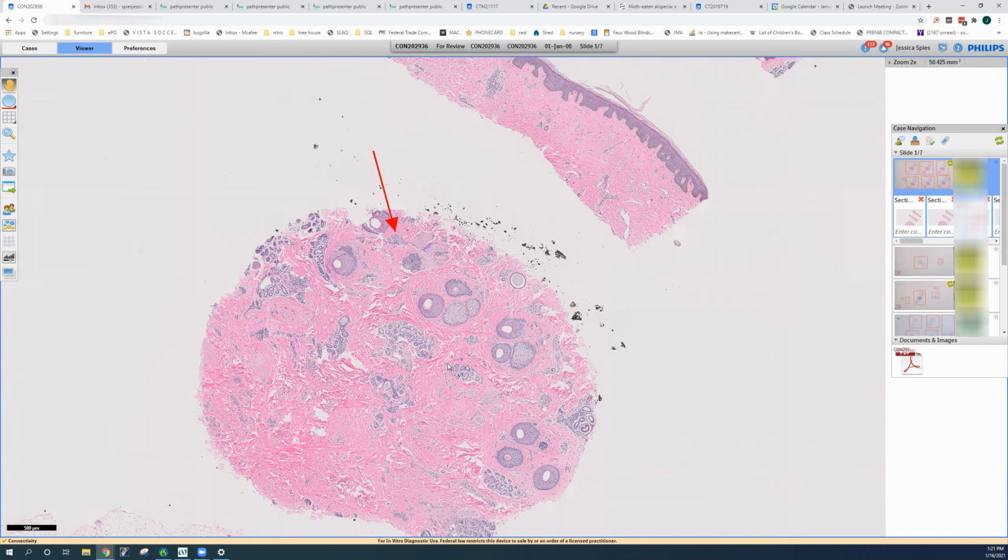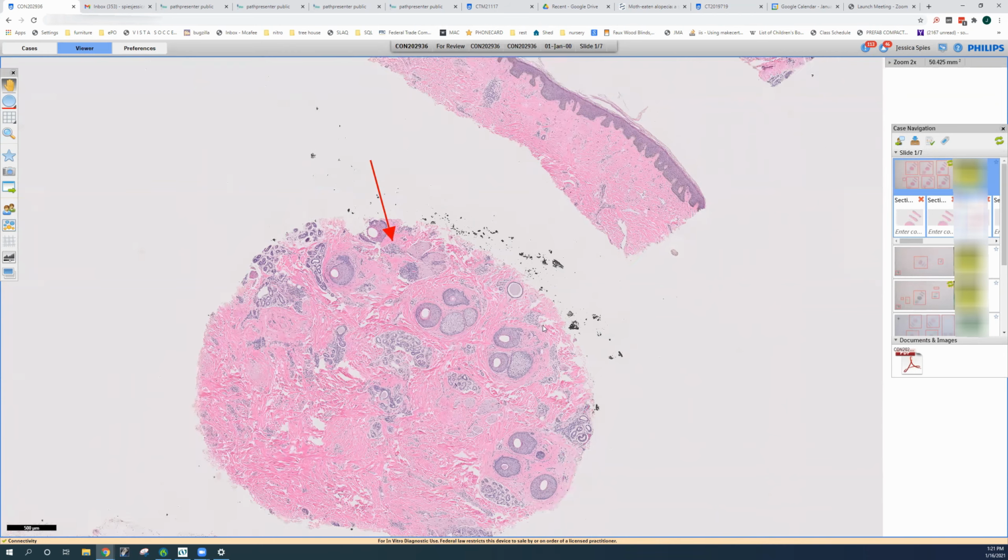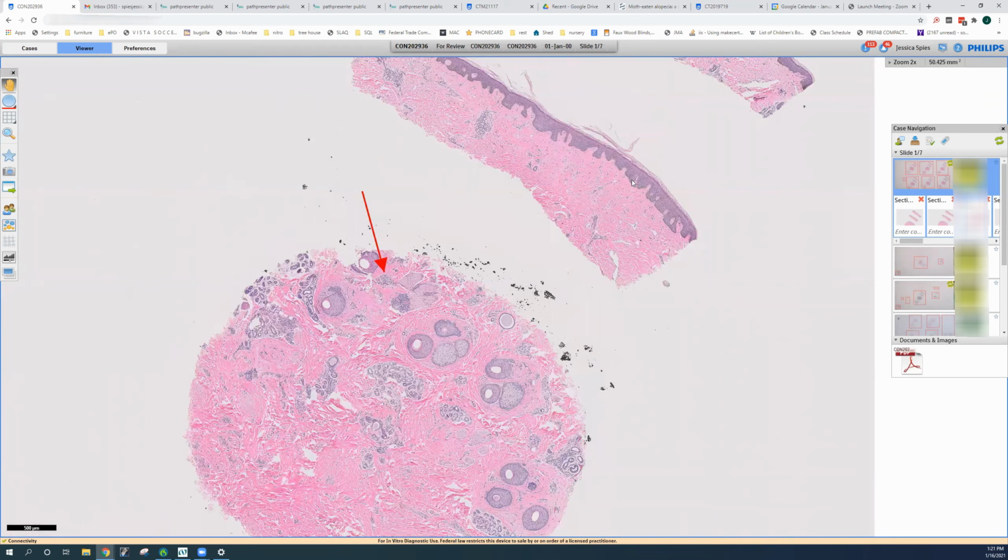Other things to think about in the histologic differential diagnosis: tinea capitis, which we don't have in this biopsy, but if you have the spongiosis and neutrophils in the epidermis, it can be. Clinically, tinea can also have a moth-eaten pattern. But of course, the PASD stain will reveal tinea. That was done in this biopsy, and that was negative.